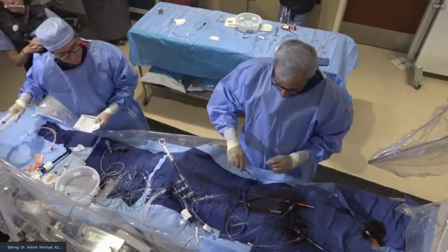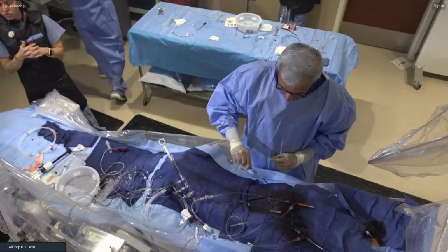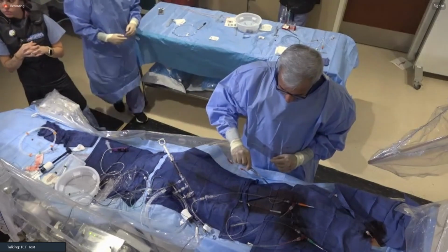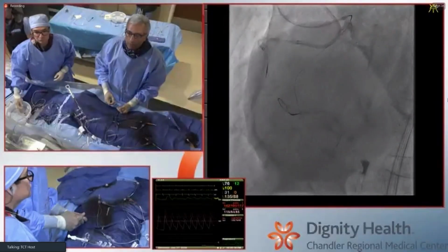Here we go, gentle injection. Any power knuckle? I think we were just discussing that, right? As a power knuckle or a base, for which he'd need a second wire, but I think he's confident that with an antegrade Carlino he'll be able to disrupt enough to get going.